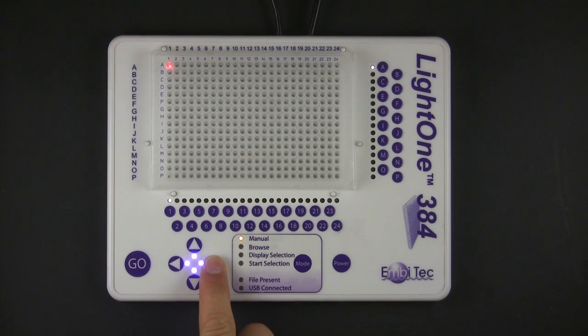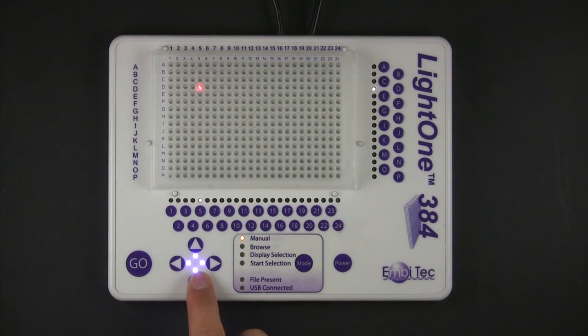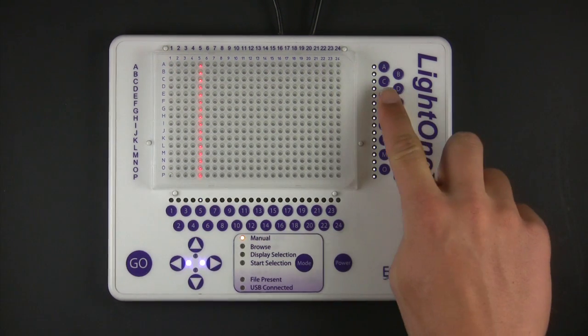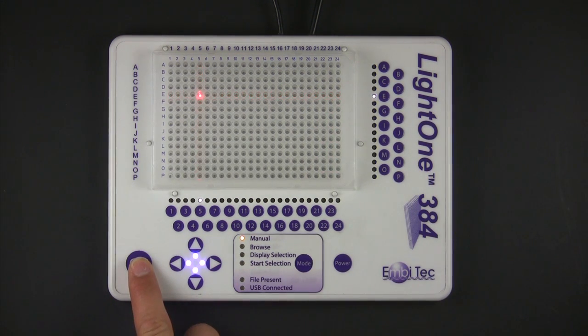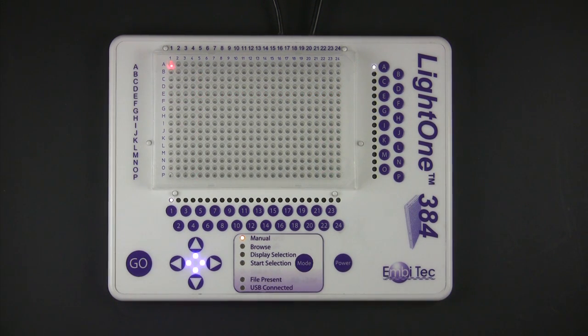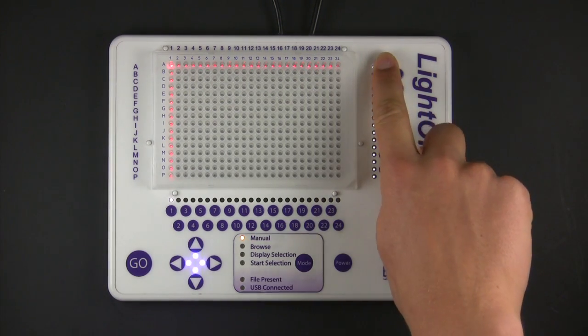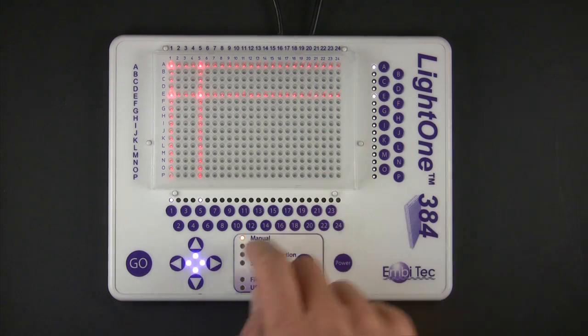While in manual mode, the arrow buttons can be used to move the tracking position one unit at a time. To select a specific position on the grid, press the legend buttons for the number and letter, followed by the Go button. To select a rectangular area on the grid, press each of the legend buttons for the four coordinates of the rectangle's corners, followed by the Go button.